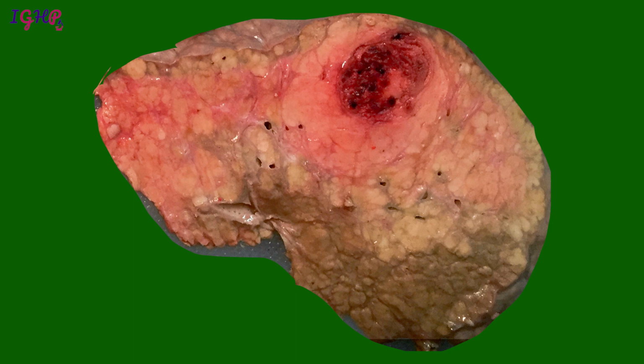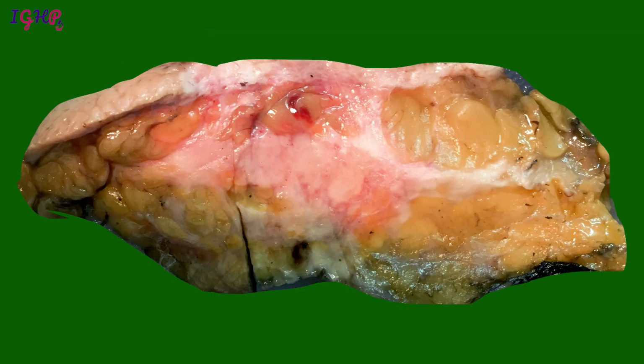So the lesion is relatively ill defined. In addition, the lesion is showing partly lobulated architecture, or rather partly nodular architecture, and it is also showing some areas of hemorrhage and necrosis. When you see a tumor showing a lot of hemorrhage and necrosis, the term that we commonly use is that the tumor is showing a variegated appearance. Here, the tumor is predominantly greyish yellow, grey white in color, with areas of hemorrhage and necrosis.